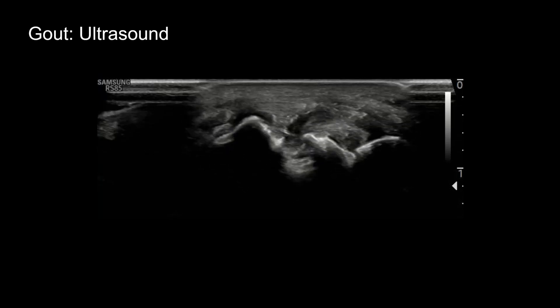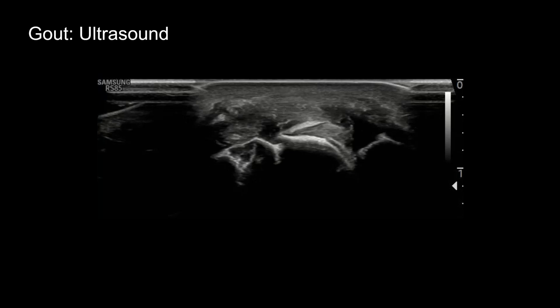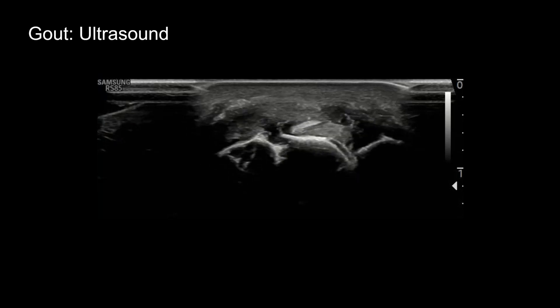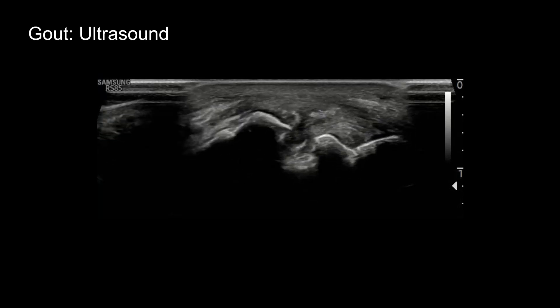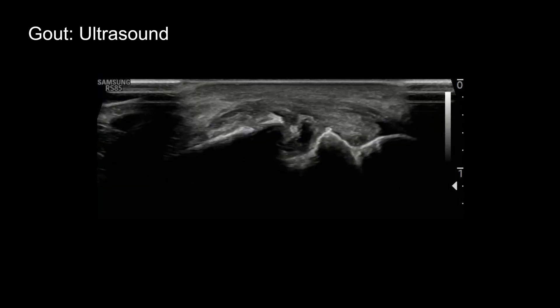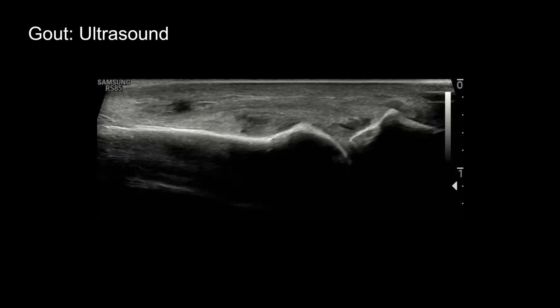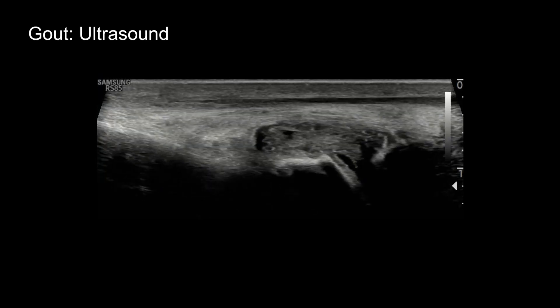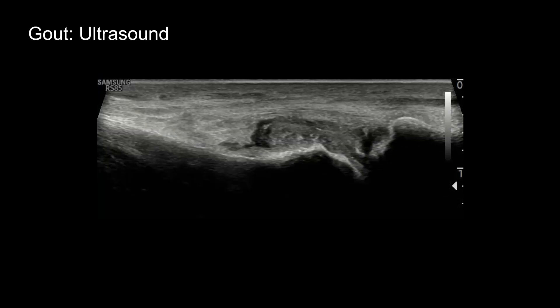Here we're looking at the metatarsophalangeal joint of the toe in long axis. Notice there's an erosion here with overhanging edges, another erosion there, and then a large erosion — all periarticular in distribution — with synovial thickening within it. When we move a bit more dorsally, we see the normal contour of the metatarsal head, which should be smooth without any erosions or irregularity. Then we see that complex joint effusion with synovial hypertrophy and all these little punctate echogenic foci representing crystals.